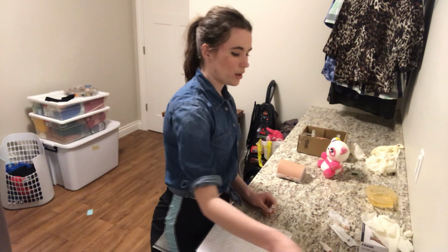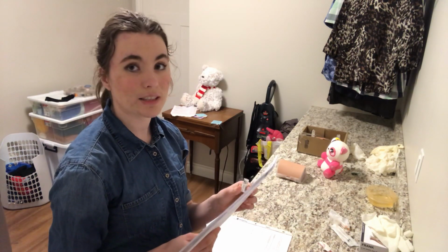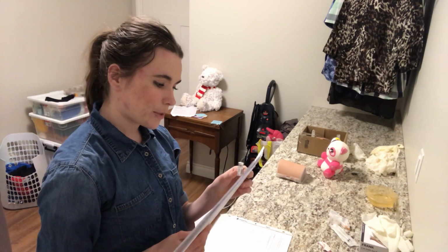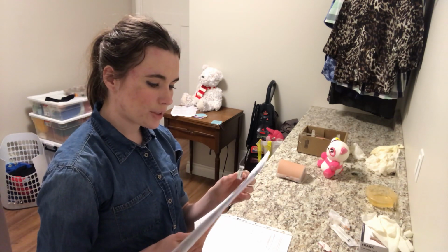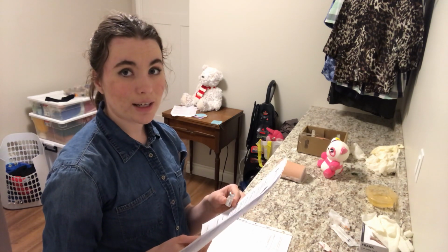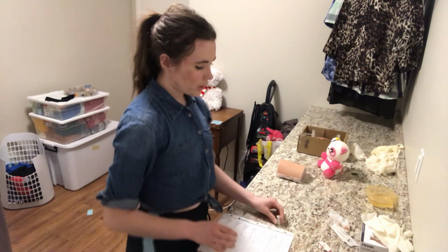So now I'm going to compare it with my monograph, and I see that it is a high alert medication, but that's mainly if you're giving it IV, and we're giving it subcut. And it is an anticoagulant. And as I mentioned, it can be administered by a student nurse, and the normal dose is 5,000 units subcut every 8 to 12 hours, and we actually give 5,000 units every 24 hours, so we're within a safe dosage range. So now that we know that, I'm going to perform hand hygiene.